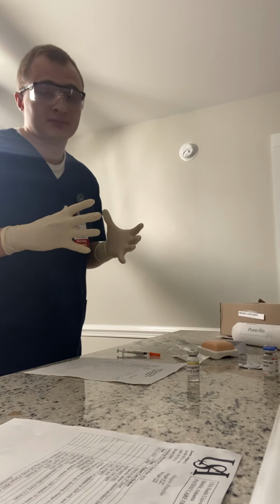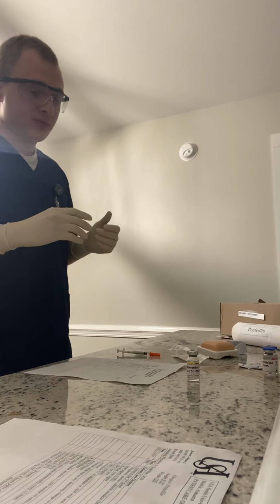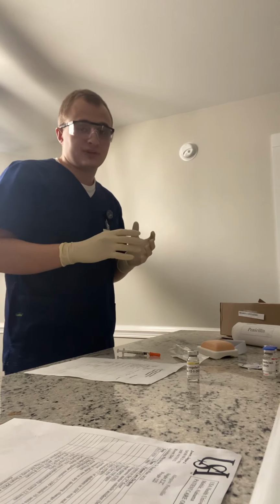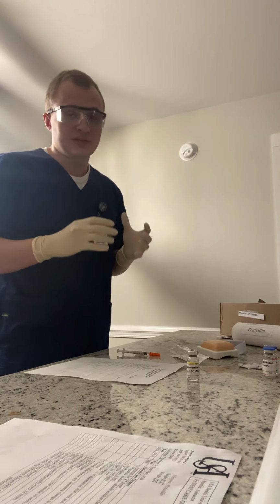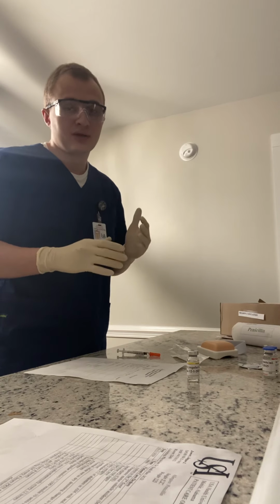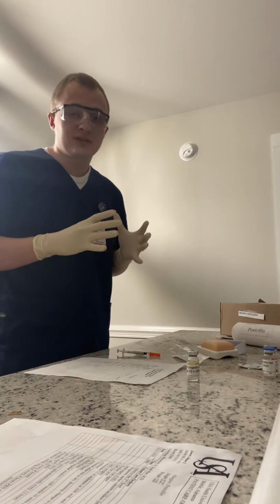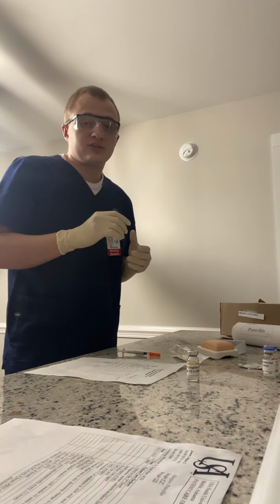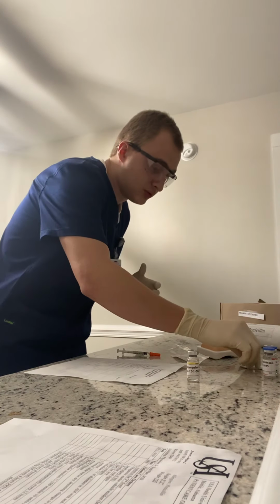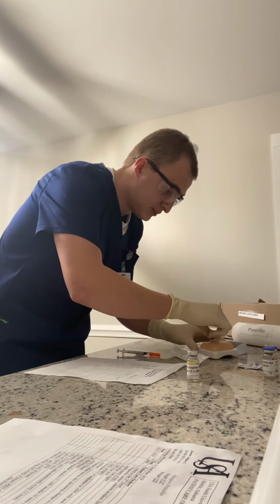And I would select the right insertion point, and we will be performing it on the dorsolateral aspect of the upper arm, which is 3 fingers down from the deltoid insertion on the humerus and 3 fingers up from the olecranon process of the elbow on the lateral side of the arm. And since this is an insulin injection, we will be going at a 90-degree angle, and we do not need to aspirate. Okay, so I will cleanse the skin, going in a circular motion from the center.